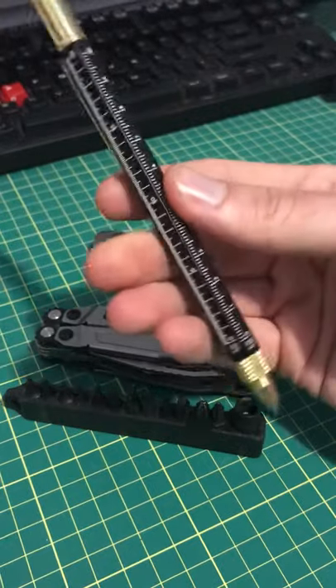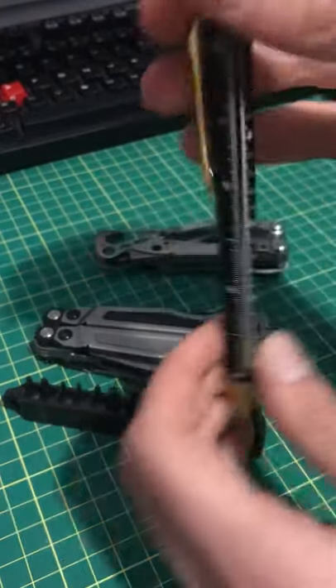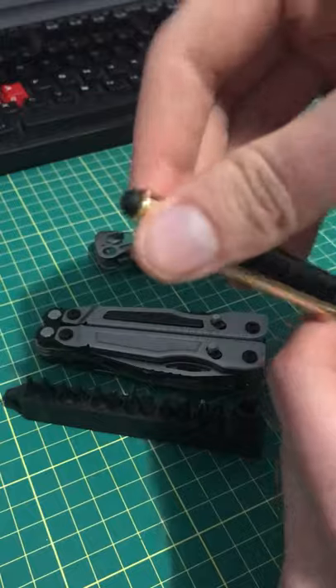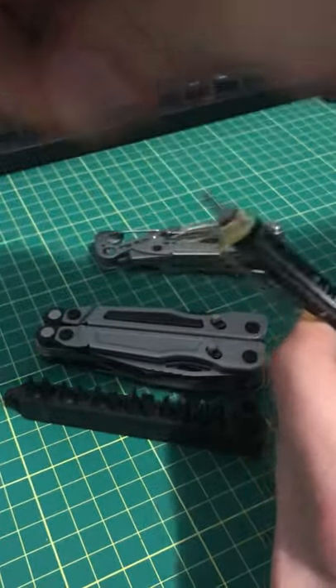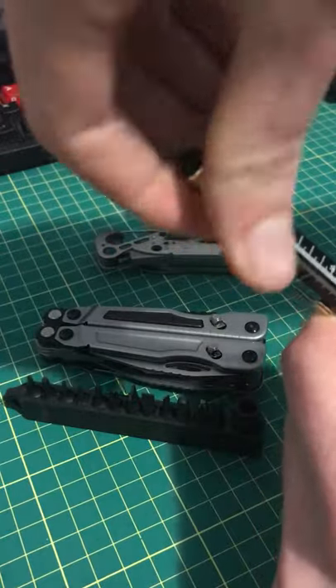It's got a level. It's got some rulers. It's got a pen. It's got a rubbery thing for using with a tablet. It's got a screwdriver. There's a flathead in there too — I can't pull it out right now.